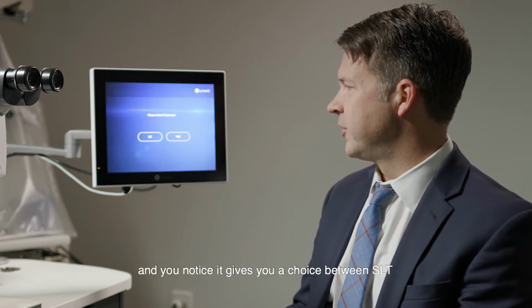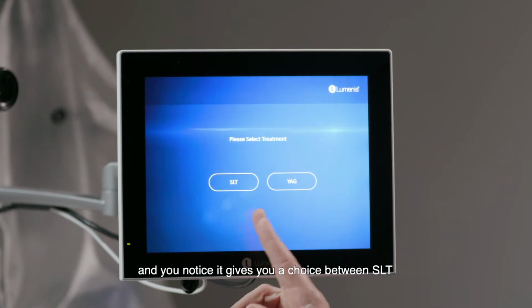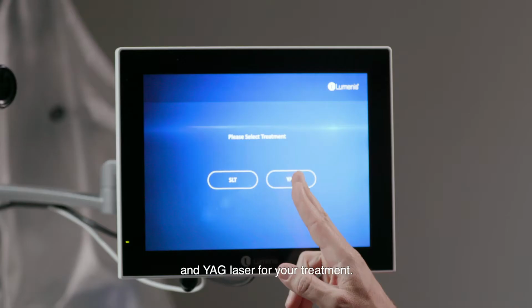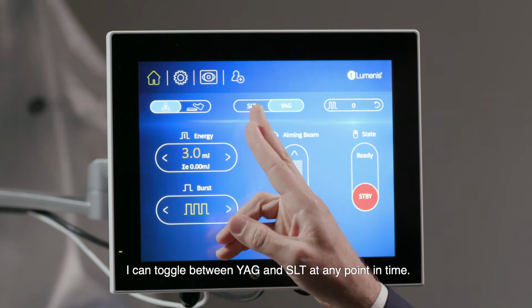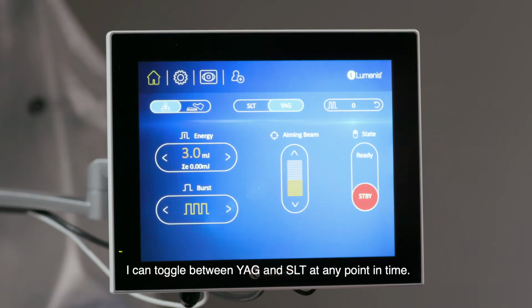All right, well, this is the first screen that we see with the laser when the laser is powered on. And you notice that it gives you a choice between SLT and YAG laser for your treatment. Here we are on the YAG laser screen, and as you can see, I can toggle between YAG and SLT at any point in time.